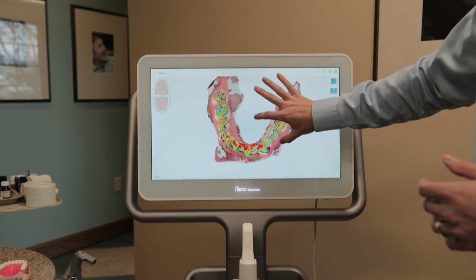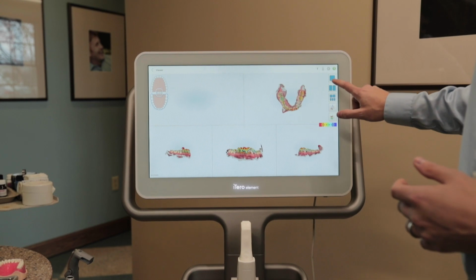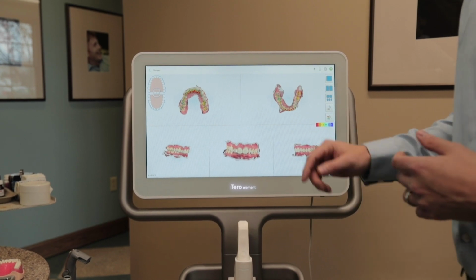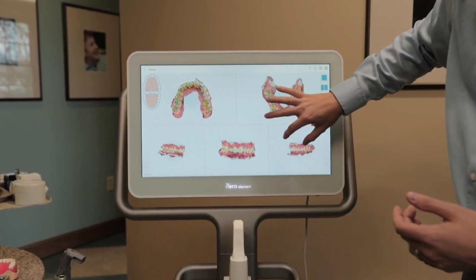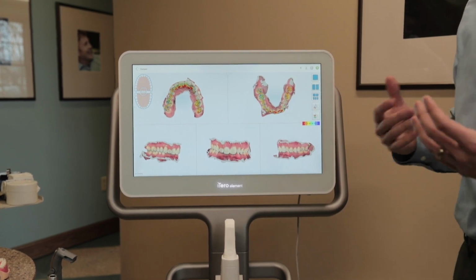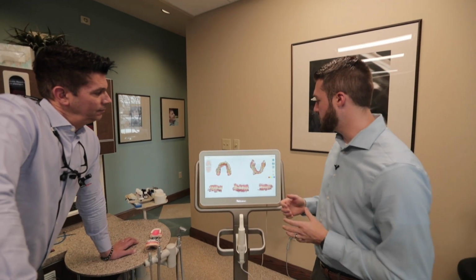So now what we're really getting into, each patient, we like to pull it up in this view here. Let's see, kind of side by side. I have the upper off, that's why that was doing that. There we go. So we like to actually educate the patient all around the mouth, and we call this going over malocclusion, just what exactly is going on, an analysis of their occlusion, really explaining to them what's going on and why we see areas of concern.